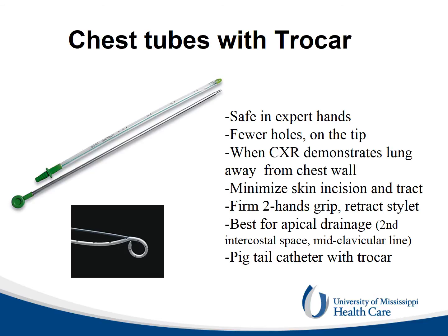tip allow to penetrate the subcutaneous tissue and the intercostal muscle without the need for a dissection once the skin incision has been made. They require a firm two-hand grip and the retraction of the stylet once the operator feels that the tip has penetrated through the pleura. They are very safe in expert hands.